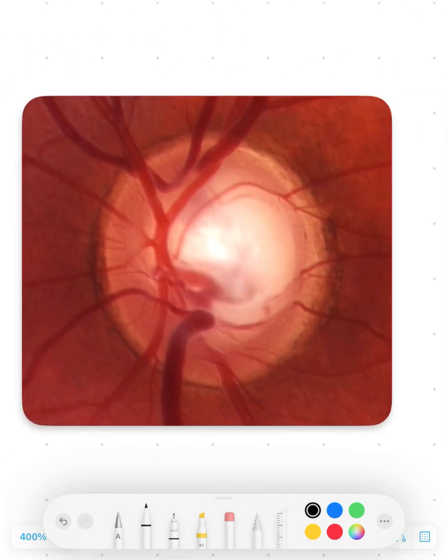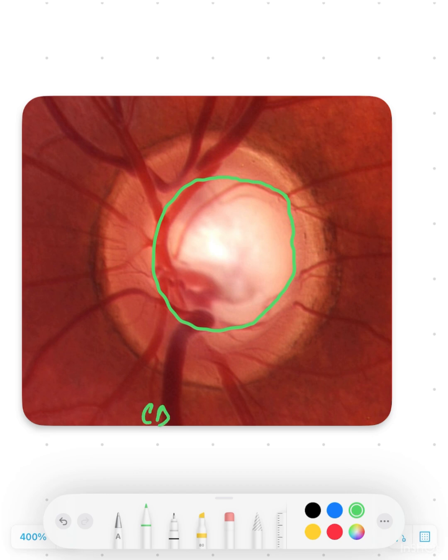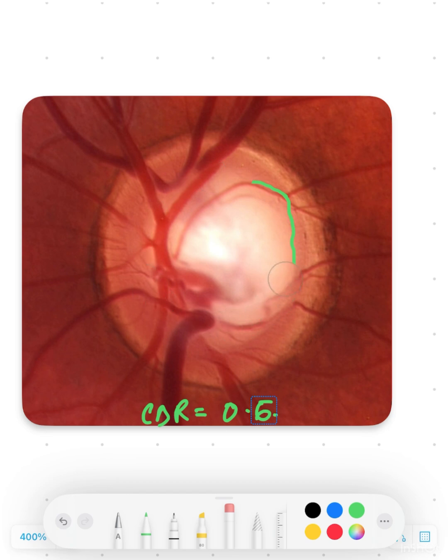Now, what do you think is the cup-disc ratio of this second disc? If you look at it and analyze the yellow part, you might find that this is the cup, giving a CDR of around 0.5 or 0.6. But when we assess it the right way — according to the bend of the vessels — we get a different scenario.